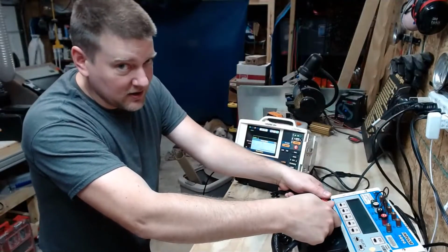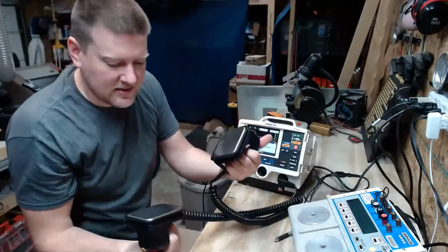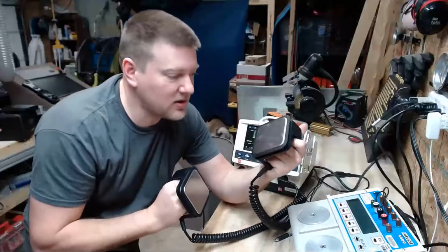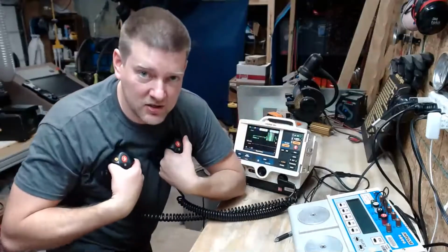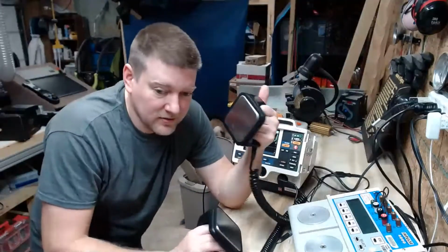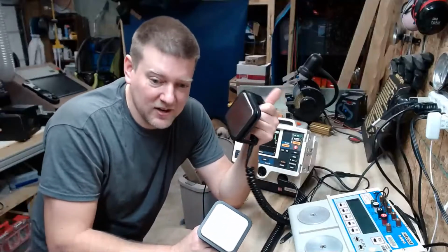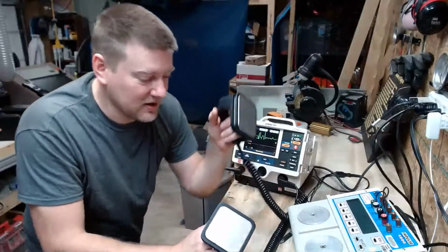You want to make sure that you got good contact on this because you don't want pitting or anything like that to happen. You got to make sure that these two surfaces are perfectly defect free because if there's any pitting, any rust or anything like that, it's going to create hot spots on your patient. When you go to energize, hot spots will cause burns. And if somebody looks at your defib and they see that's what caused the problem, and you were the last person to touch it and it's got rusty paddles, that's on you, man. And that's not going to be good.